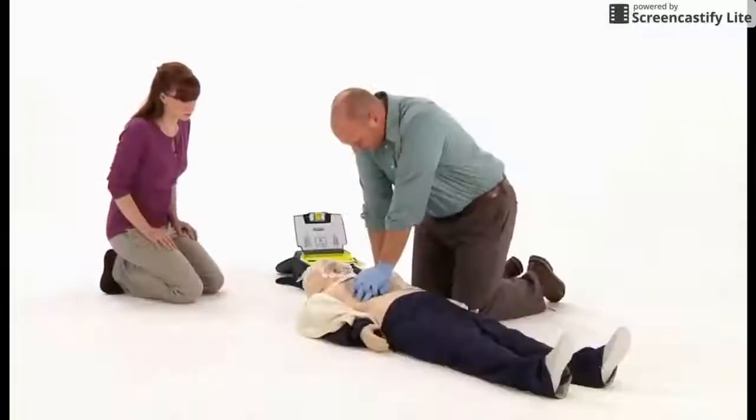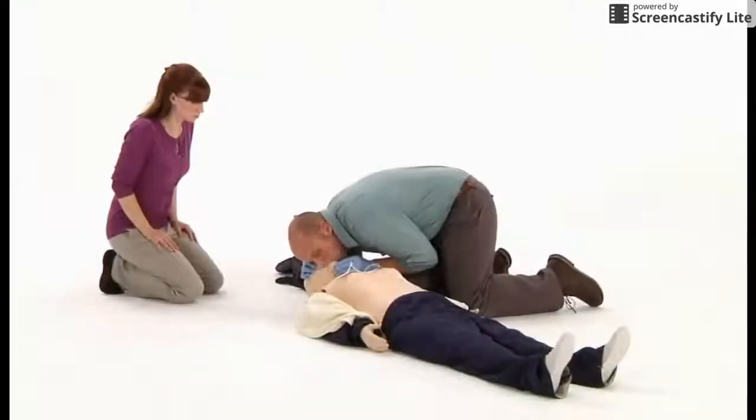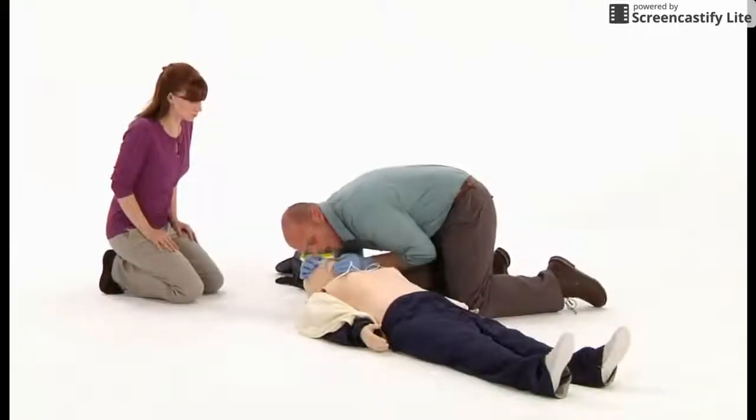Start CPR. After a shock is delivered, or if no shock is advised, give about 2 minutes or 5 cycles of CPR. When 2 minutes have passed, the AED should automatically begin to reanalyze the heart rhythm and will advise you with a prompt to stay clear of the person.